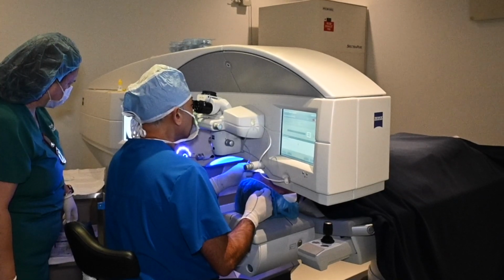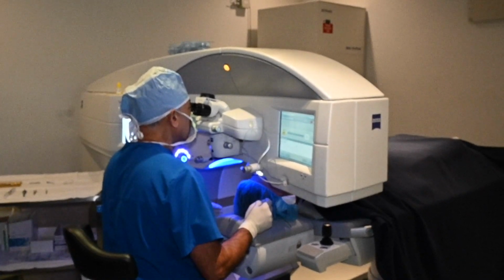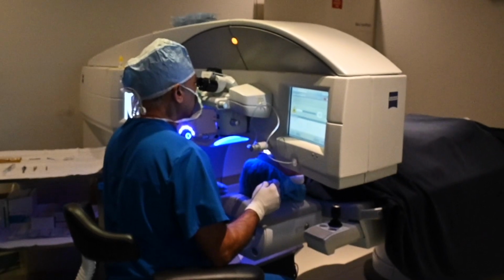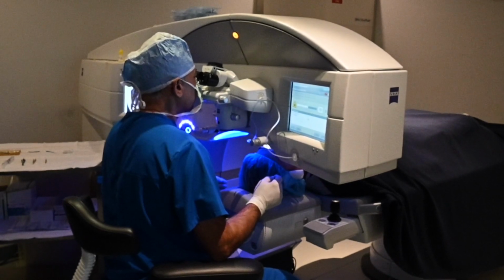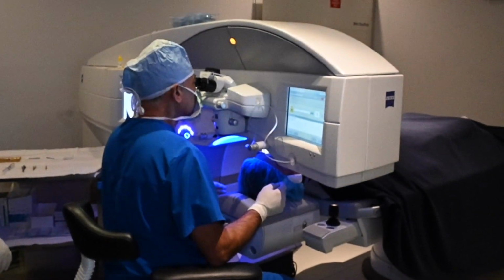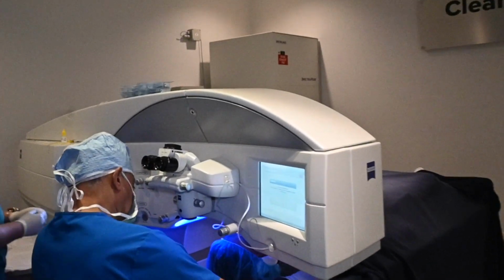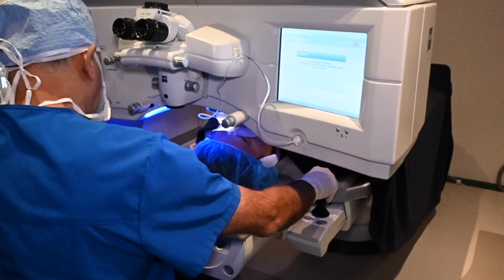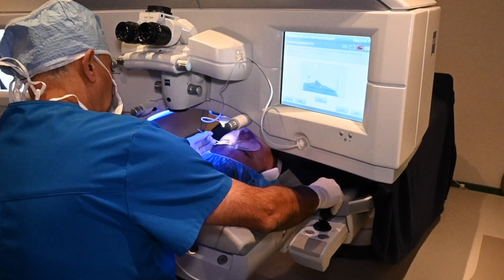Now, any new surgery, including LASIK, took many years to reach where it becomes good and attractive, as the benefits outweigh the risks and the nomograms get perfected, so the outcomes are very precise. And that's what happened between 2011 to 2017, where it was being researched and used abroad and in FDA studies, when FDA approved it. And then, after FDA approval, there's always a post-market process, which we observed between 2017 to 2021, where the nomograms became tighter, the outcomes better, the software upgraded.